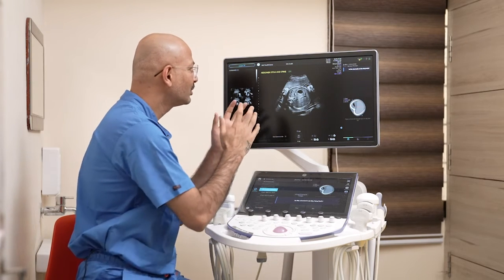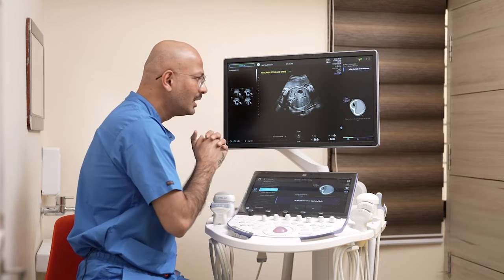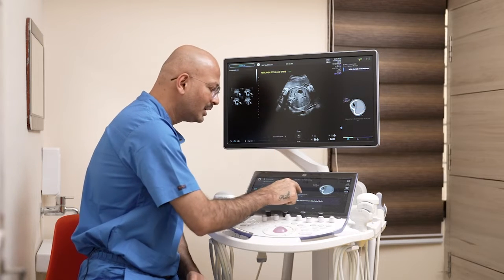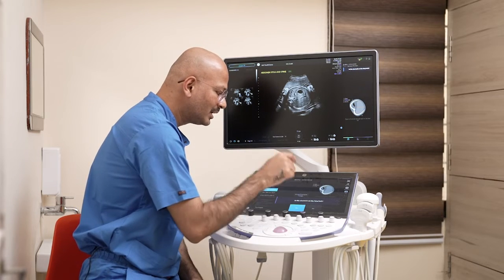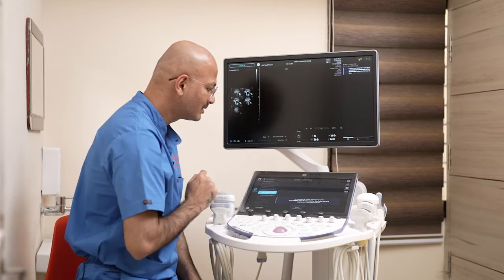Now it is asking for the stomach position. It is on the left side, so I'm clicking yes.